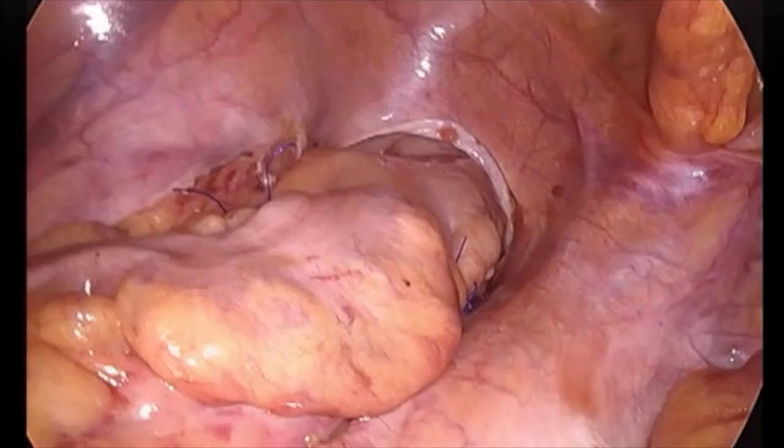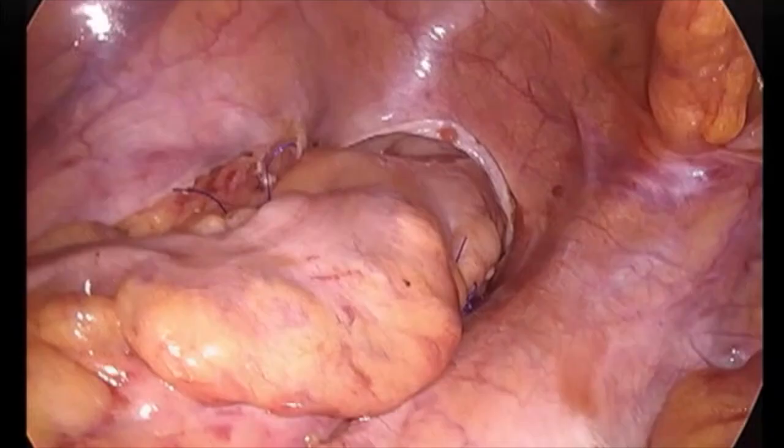There you can see the rectum is now lying straight and fixed well. Thank you all for watching.